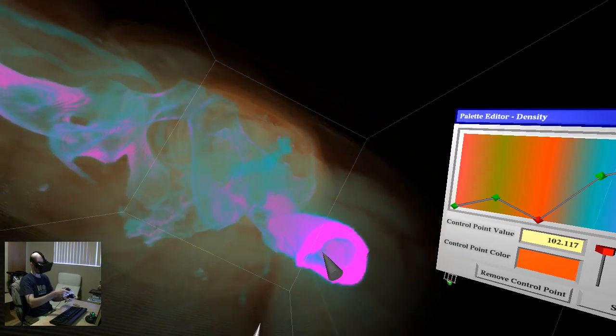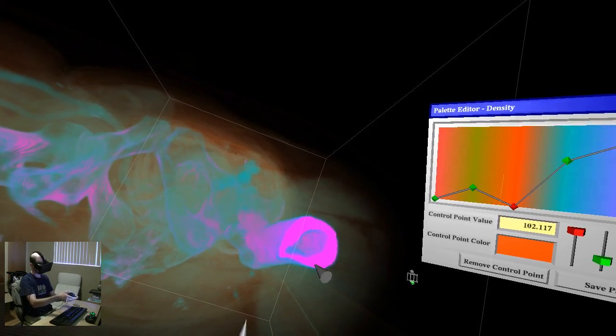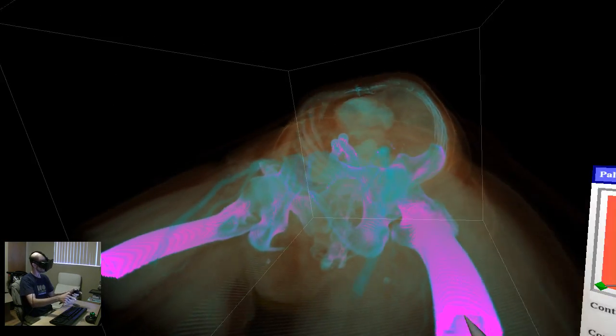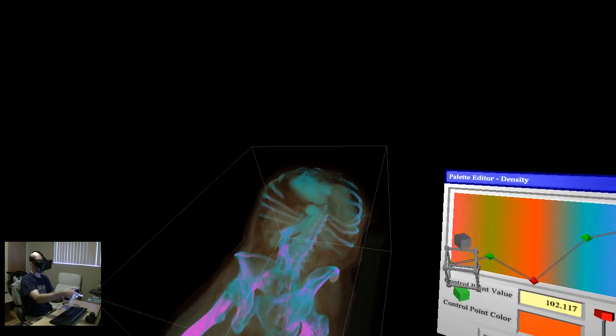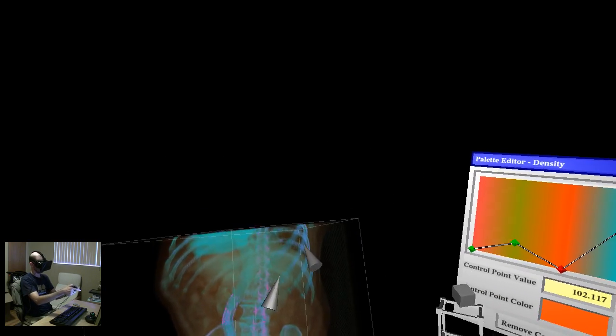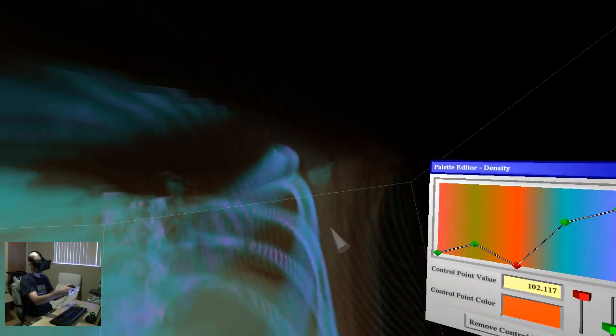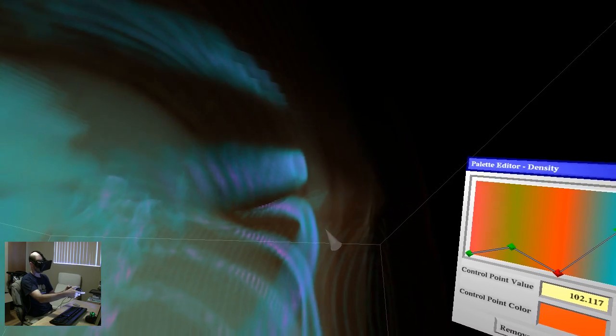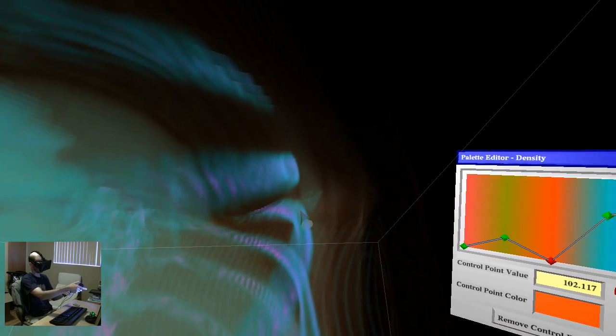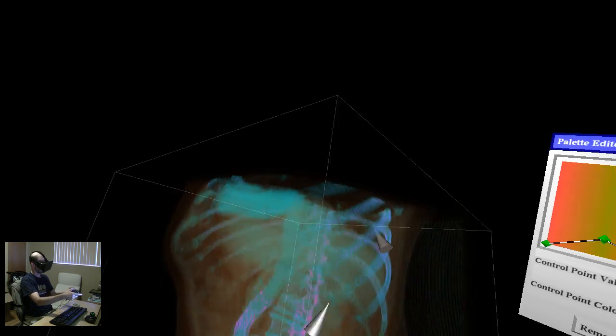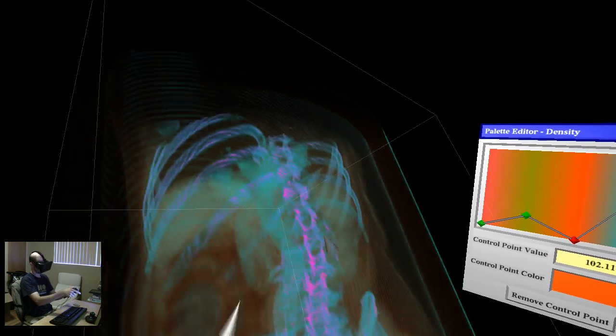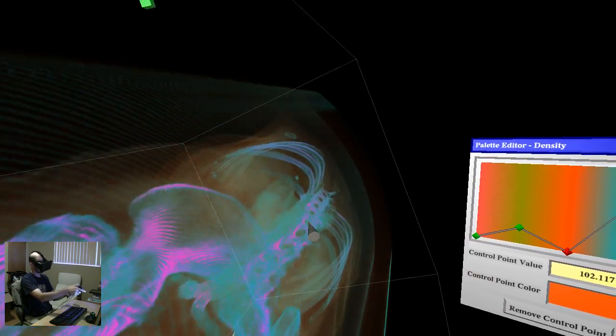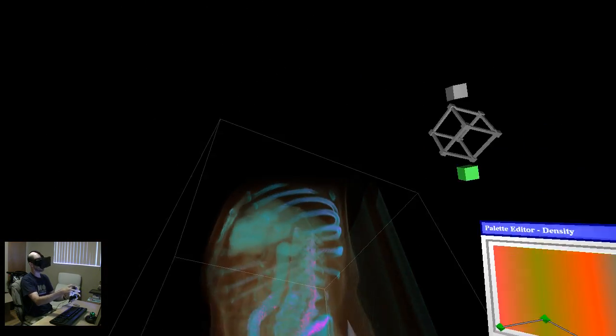If you look here, you can see even the heart part of the bone right there, the bone marrow in the middle, which has a lower x-ray density. You can see the same thing here for the ribs. You can see they almost look like they're split in half because they're very thin up there. And then here, of course, you have the spine also quite nicely resolved.